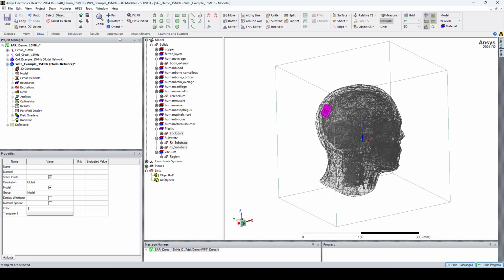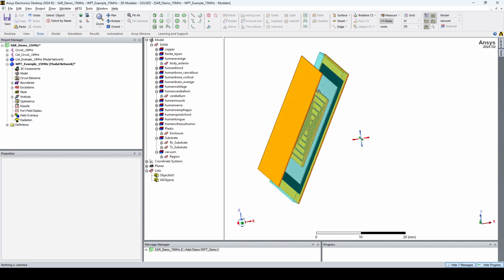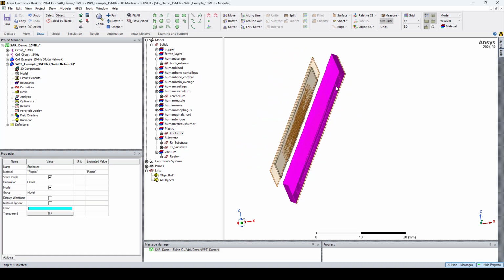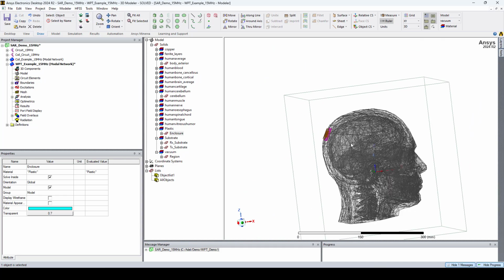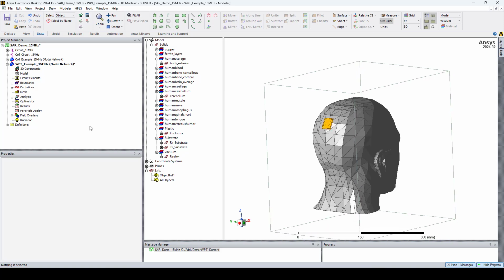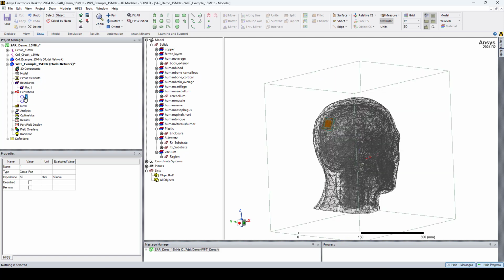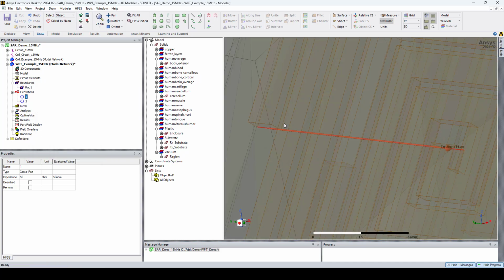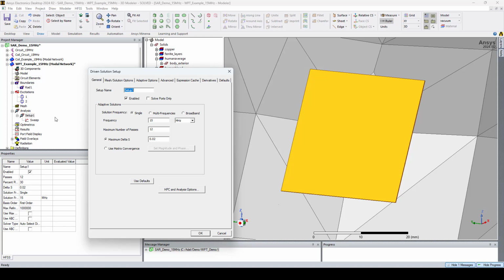Going back to the full HFSS model, a similar coil was used for the receiver with the addition of a plastic enclosure. If we look at the simulation setup, we have a radiation boundary condition applied to the airbox, and for the excitation, circuit ports are used. This is port 1 and port 2. Here's the simulation setup.